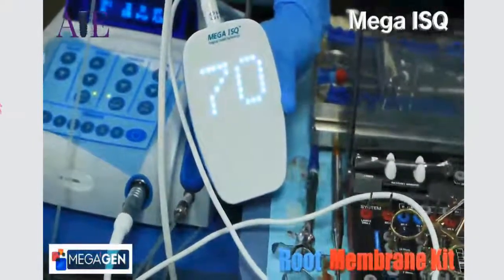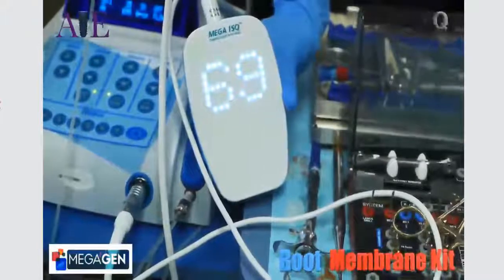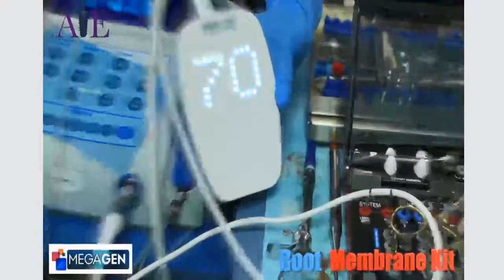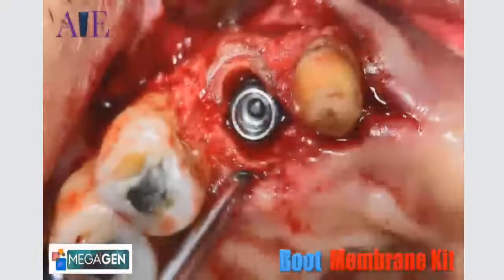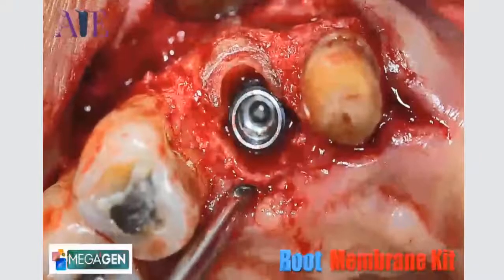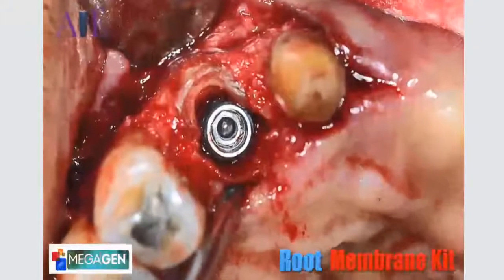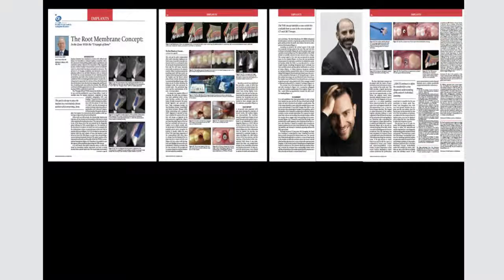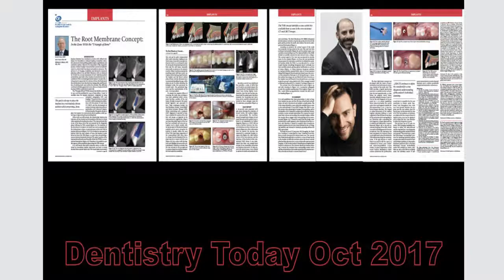And so again, we are living in a time where these digital tools are extremely important, and it helps us to be able to determine whether or not we can load these implants or not. And so here is a final picture of what that should look like. So as we start to develop some of our skills, it's important to know what it is that we can do.